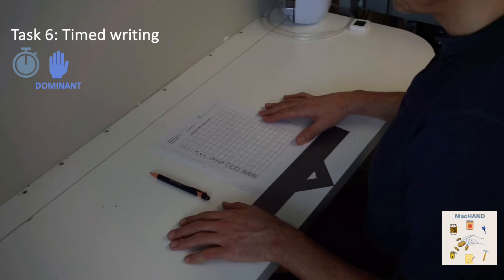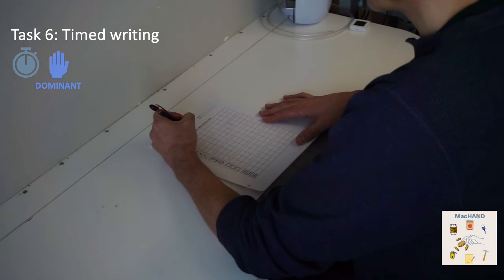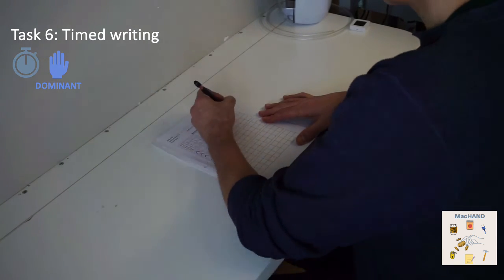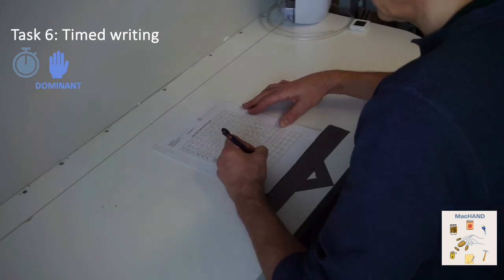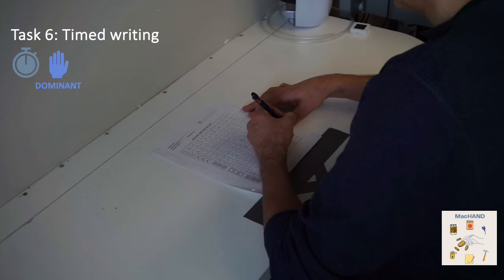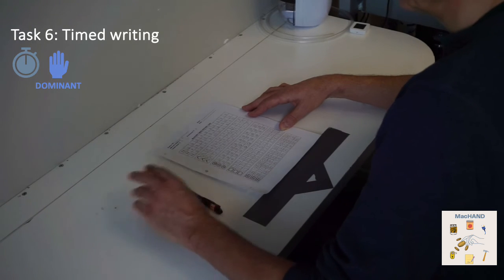In the MacHAND short form, task 6 is only completed if the tested hand is the dominant hand. So for task 6, the assessor needs a stopwatch to time the performance. The patient is asked to copy the symbols from a printed test paper as fast as possible. The assessor's focus is on the tripod pinch, fine motor, coordination, and endurance.